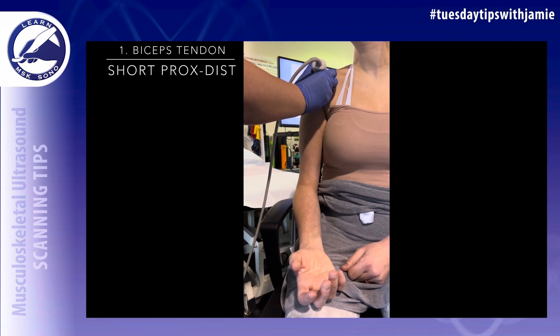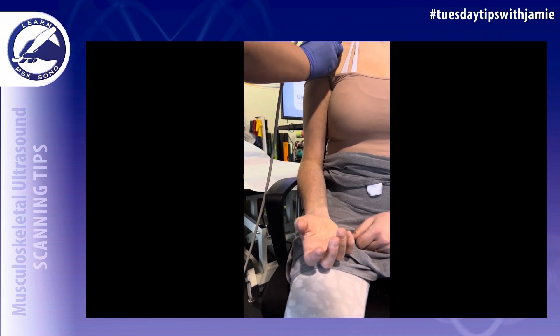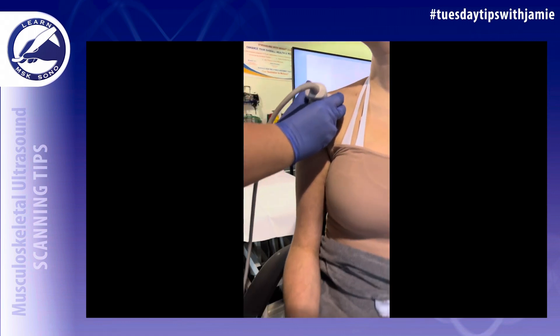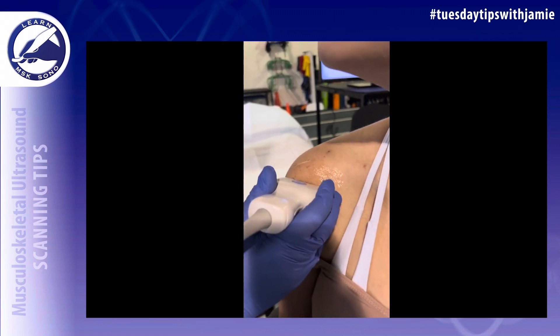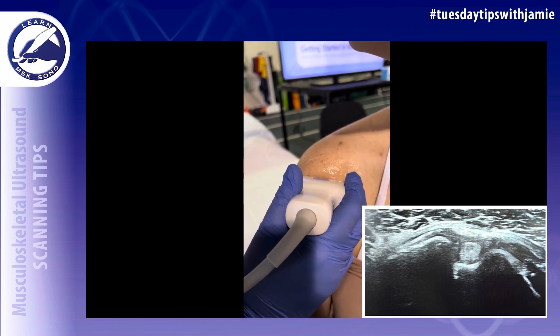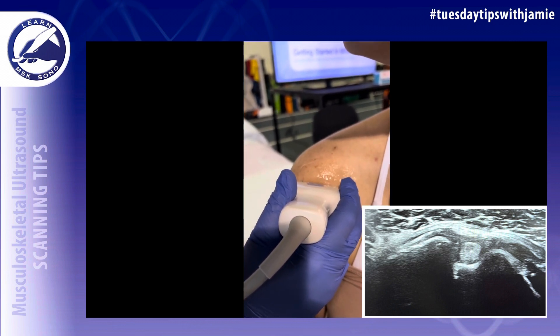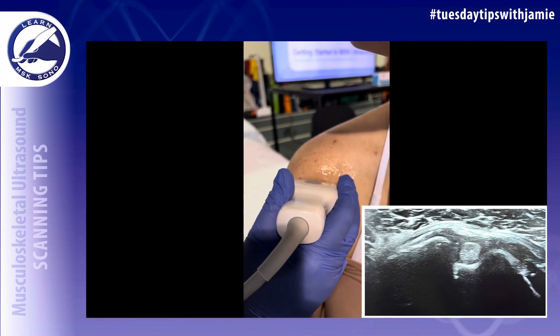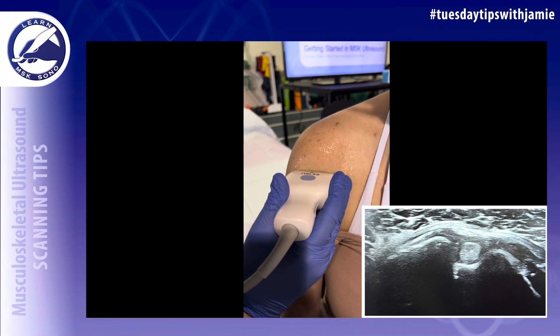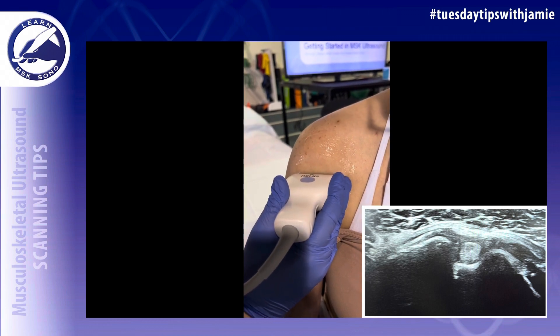Have the hand resting on the leg in a neutral position with the palm up, then place the transducer in a transverse plane on the body. Label the image 'biceps tendon short proximal to distal,' and as you sweep down from proximal to distal, tilt up to eliminate anisotropy.